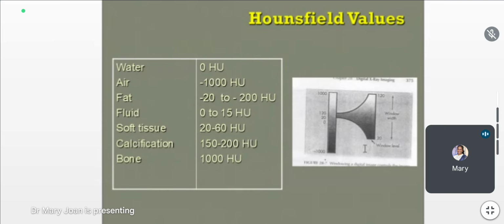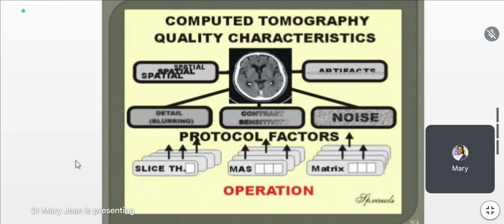So, different Hounsfield units, we have seen this before also. There are hard bone and soft bone also. From -1000 through 0 to +1000, the Hounsfield unit varies. So we will have more discriminatory power to identify tissues of varying density, which are near in densities also, when it is spread across a larger scale. We have seen this before.